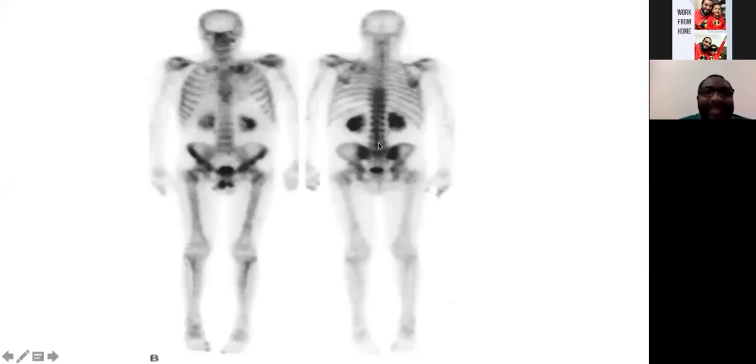Okay, good. So this patient is a 63-year-old male who is recently diagnosed with squamous cell carcinoma of the lung, and he's sent for a bone scan for staging. Yes. So anyone? Dr. Osama Ibrahim, do you want to come again? Okay, Doctor.